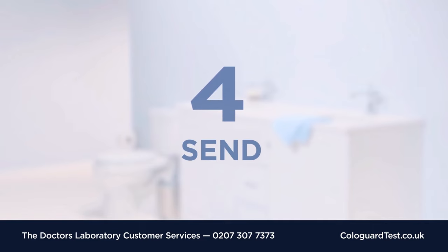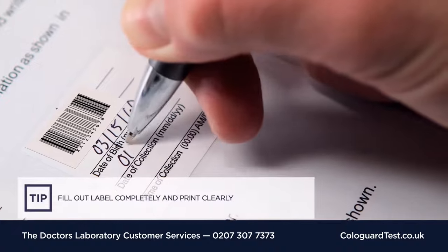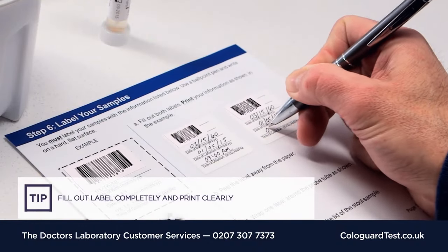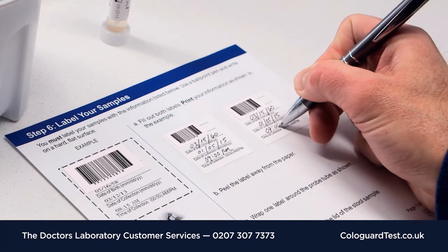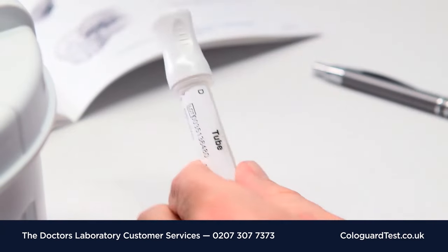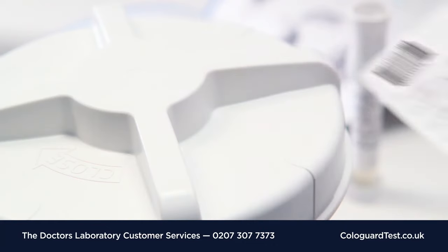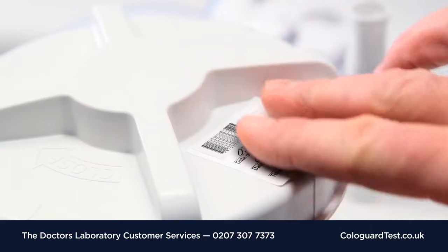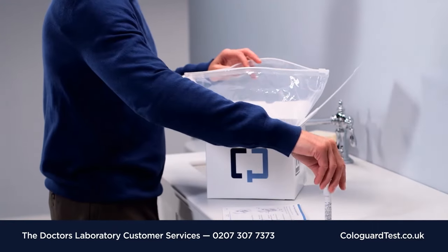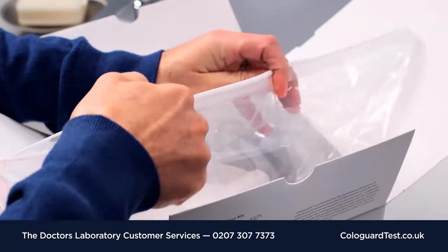Step 4. Using a ballpoint pen, fill out both labels completely. Make sure you print and include your birth date and the sample collection date and time. Peel off one label and wrap it around the tube. Then peel off the other label and place it on the lid of the container. Return the labeled components to the box, close the zippered bag, and seal.